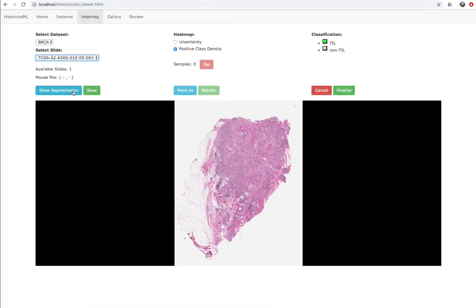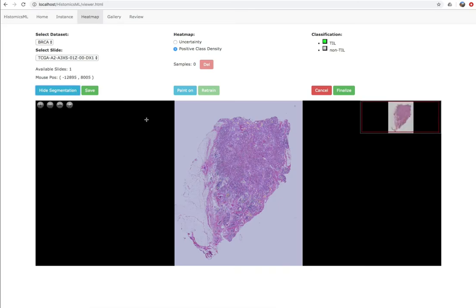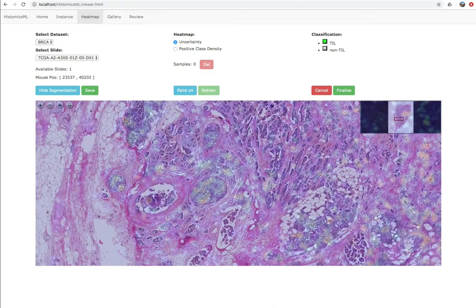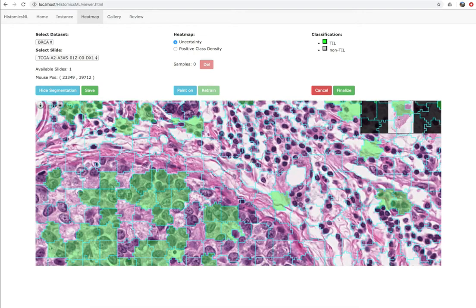For training, we've found that people like to interact with heat maps during labeling to identify areas that need correction or that are enriched with samples having high prediction uncertainty for active learning. Histomics ML provides two kinds of heat maps: one depicting prediction uncertainty and the other depicting the prevalence of samples predicted as the positive class. Zooming into a hotspot, we can see that a group of superpixels containing tumor has been misclassified as TIL, and a group of TIL superpixels has been misclassified as non-TIL. The paint tool can be used to drag the mouse over these misclassifications, labeling them and adding them to the training set.